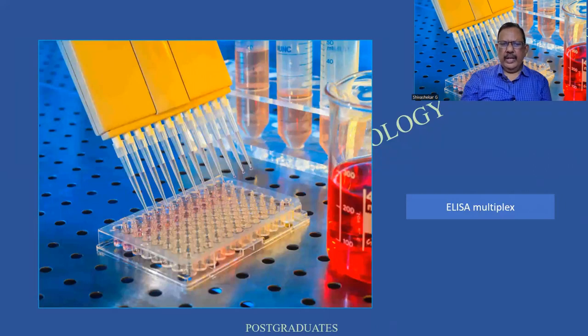So this I have already explained. I would like you people to kindly appreciate it. The only thing is that precision has mattered, and all of these are being adjusted by means of fine instruments called microtip pipettes.